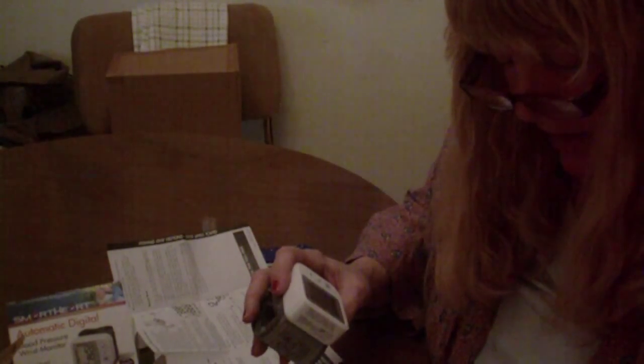I just inserted the batteries in the little battery door, which was harder to get off than I thought. But they're in there now. Setting the date and the time — when the battery is first installed, the year will begin to flash. Press the memory button to advance the year until the desired number. To scroll through the numbers quicker, hold down — press set for the year.